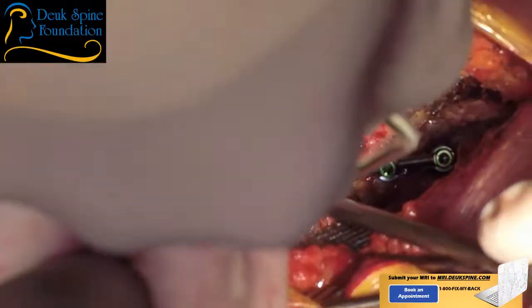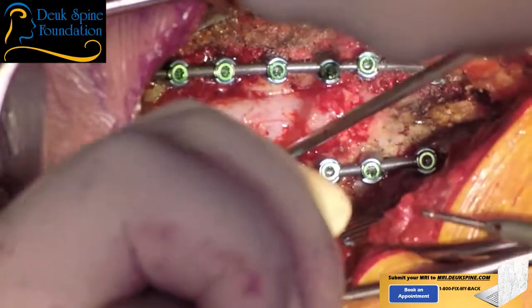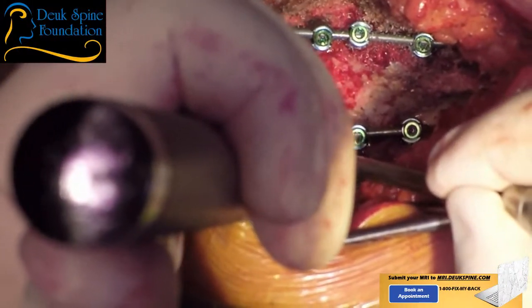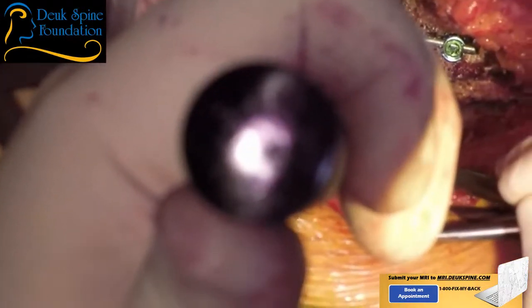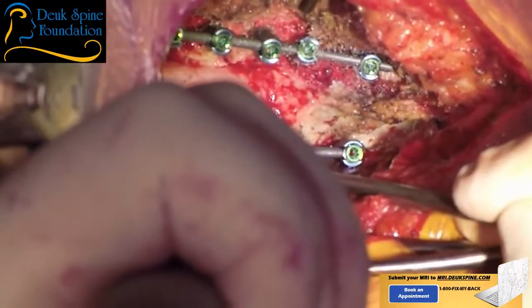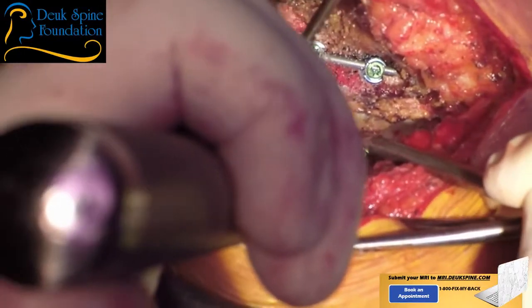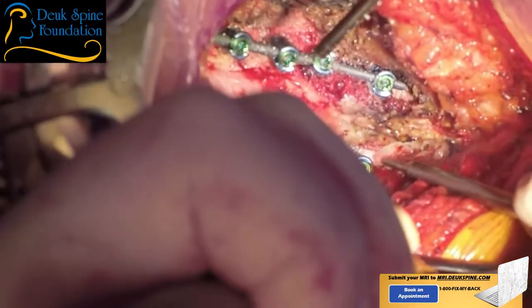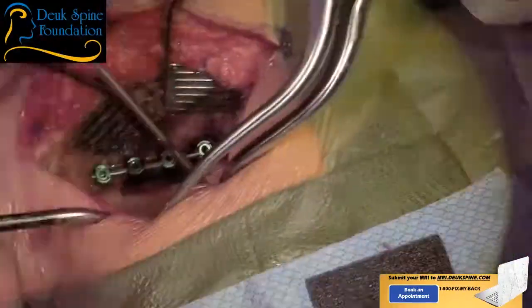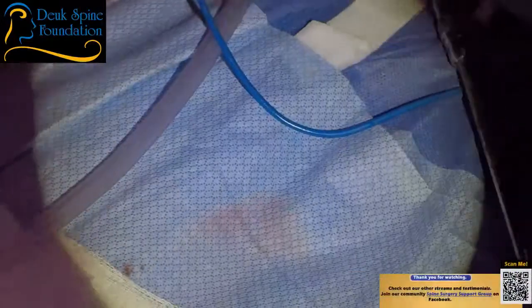So I'm going to hold the muscle over. I'm going in the facet joint, and I'm going above the lateral mass. The truth is, folks, with the amount of instrumentation I've got in here, those joints are going to fuse very nicely with minimal decortication. All right. Bone graft. We're going to put some graft in. I need Gelfoam.